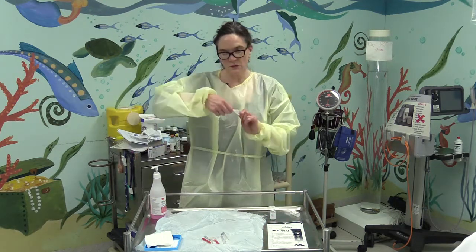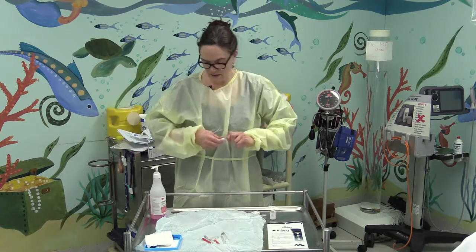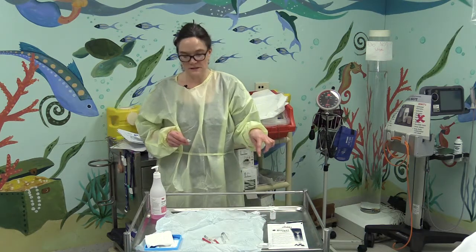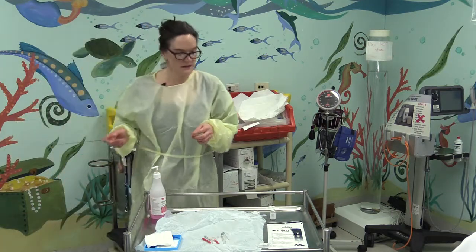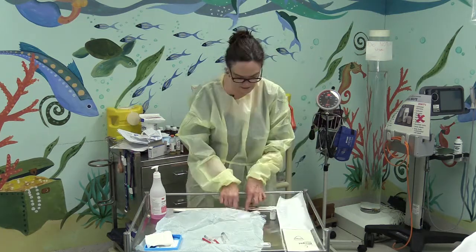And I'll do the same with the water and the saline, so that I can do this by myself if I haven't got an assistant. I'll use the gauze to hold the vials, or you can have an assistant to help. And I've got my sterile gloves.